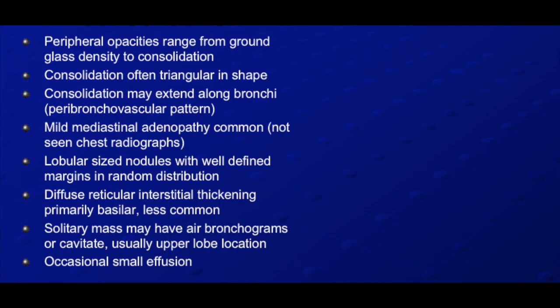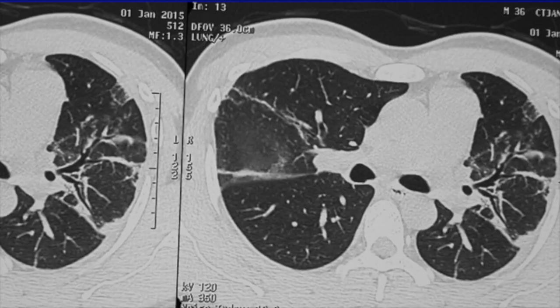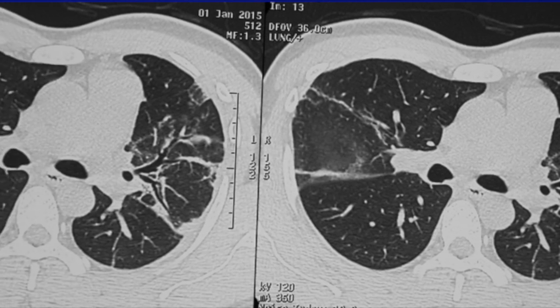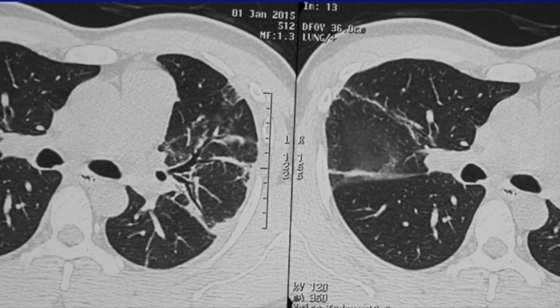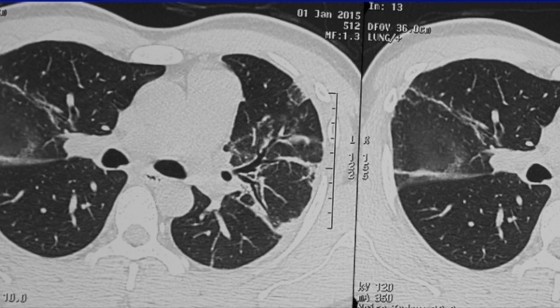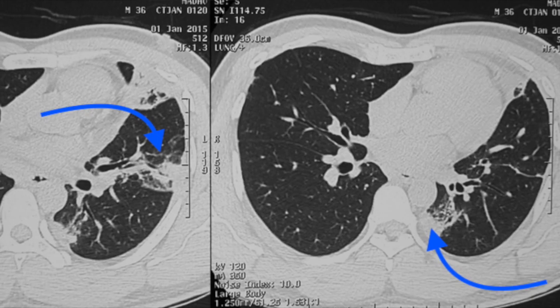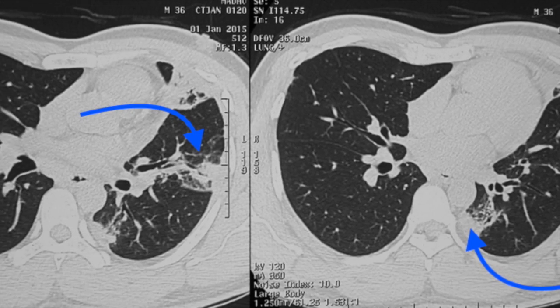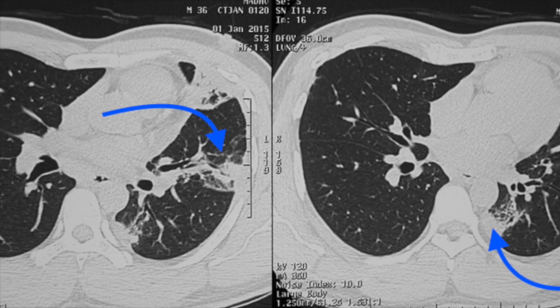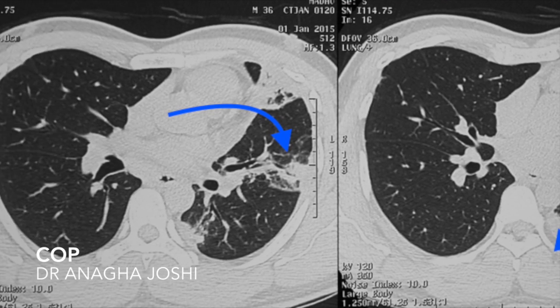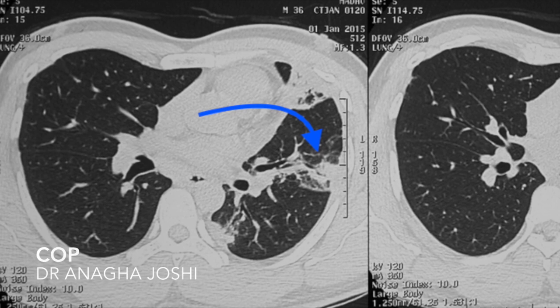You can have mediastinal lymphadenopathy. You can have pleural effusion, like in this case. There can be some amount of fever but dry cough. In a given clinical setting, triangular-based multiple consolidations with septal thickening — multiple consolidations not confined to one lobe — think of COP.